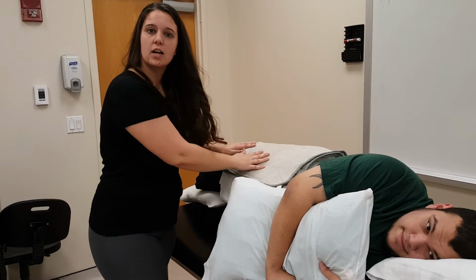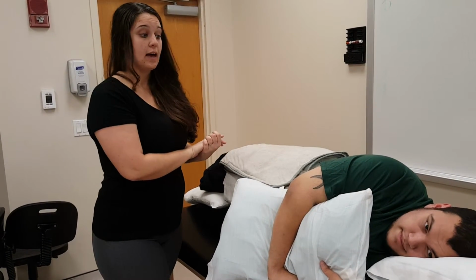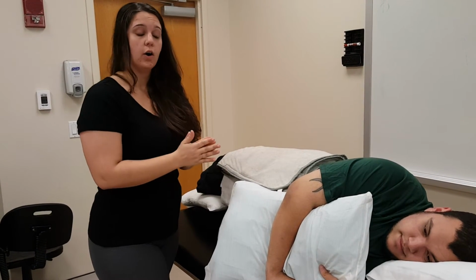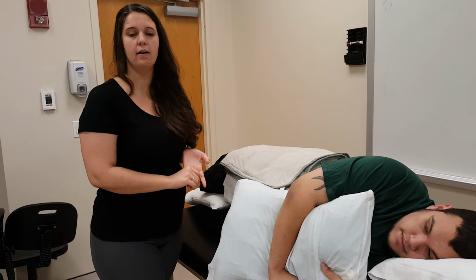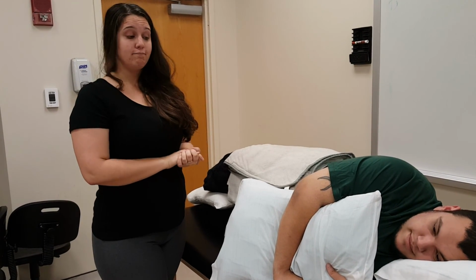I'll recheck the area to make sure that he doesn't have any excessive redness, it's not too hot or anything like that. And I'm also going to, before I leave the first time, give him a bell or some sort of thing that he could let me know if he does need me for any reason, if it did get too hot or if something goes awry. And that's all.